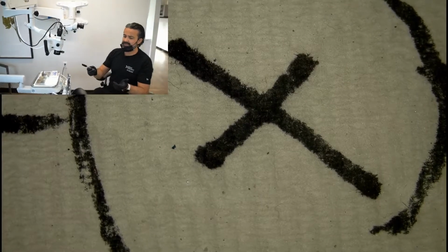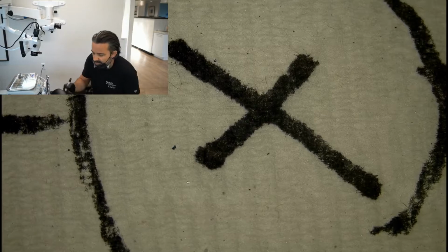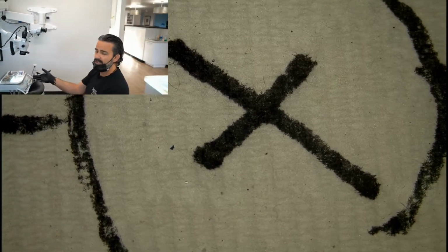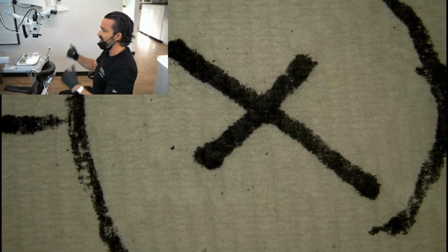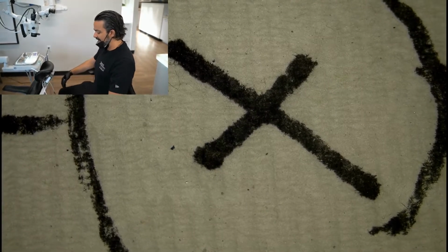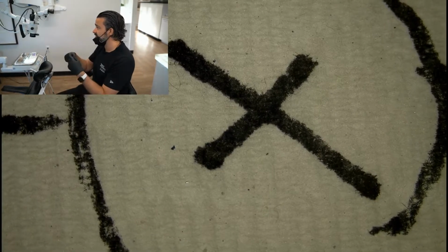The second thing, I would say, is position. When you get comfortable, like I was describing with Lindsay in the chair, just working in this 12 o'clock position, it's just more comfortable to then use my mirror and keep my posture correct. I think if you're having neck or back problems, that's something that is a huge advantage, a huge plug for the microscope.